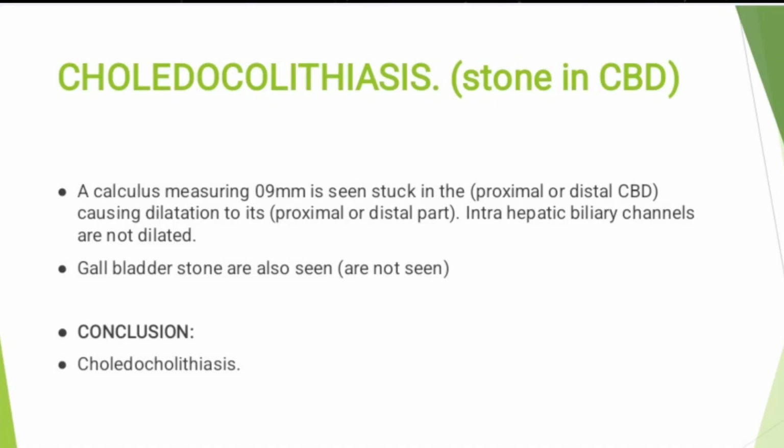We will write and mention that a calculus measuring 9 mm, or whatever the size is, is seen stuck in either the proximal or distal CBD.